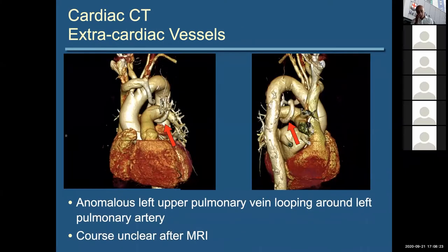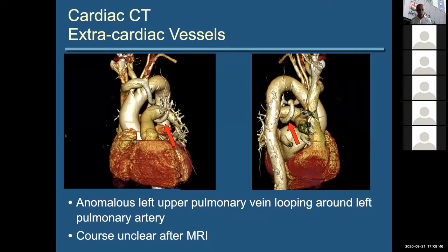Where CT is really preferred is for looking at straight anatomy, particularly vascular anatomy. Here's a patient where the left upper pulmonary vein was difficult to follow on MRI, but on CT you can see quite nicely that it's doing a 360-degree loop around the left pulmonary artery before ascending and draining anomalously into the innominate vein. CT becomes a fantastic tool for working out what's connected to what, which is why I'll use it for a lot of this talk.